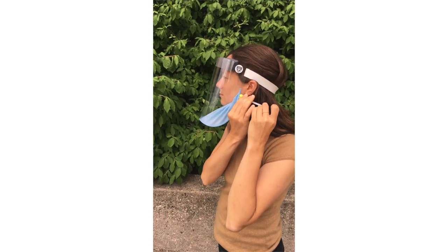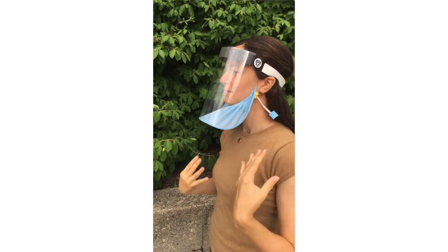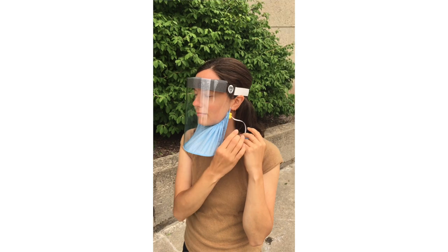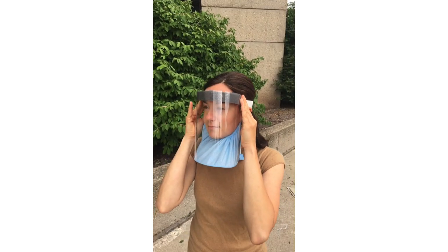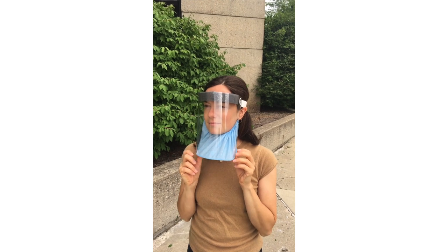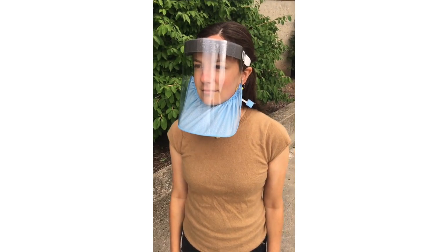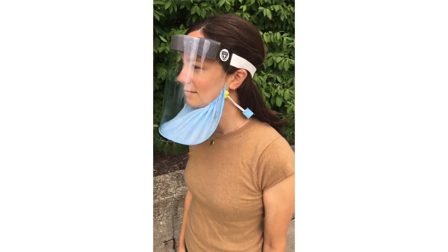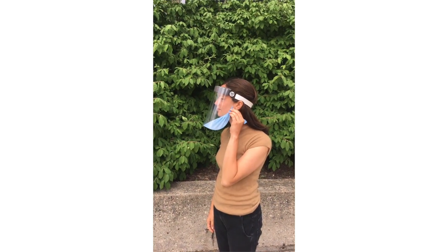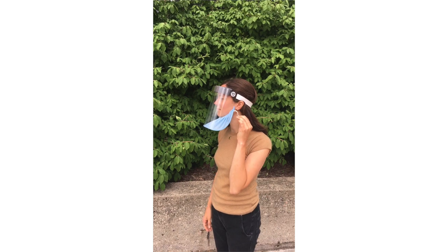It meets the clinical needs of UW Health as a class 1 face mask with a shield, but is not a respirator. There are gaps on the sides that can be adjusted from open to mostly closed, and it uses H100 sequential sterilization wrap for its shroud. This fabric has comparable filtration characteristics to that of a high-quality three-layer cloth mask, based on preliminary tests by the UW-Madison College of Engineering.